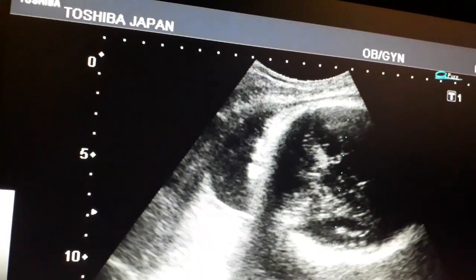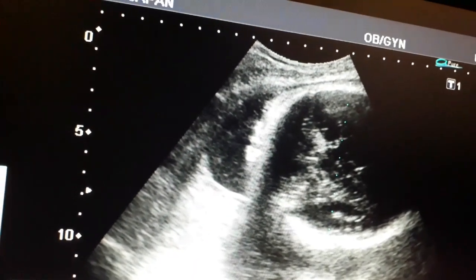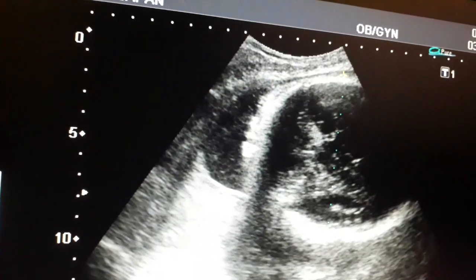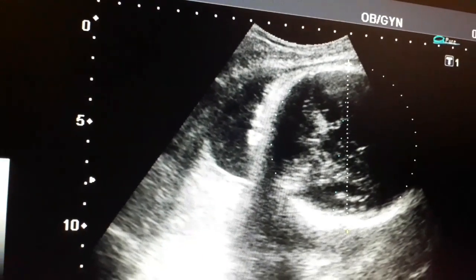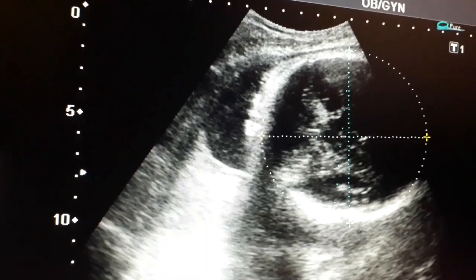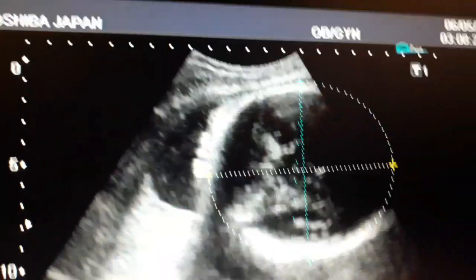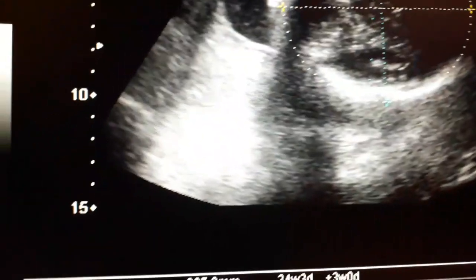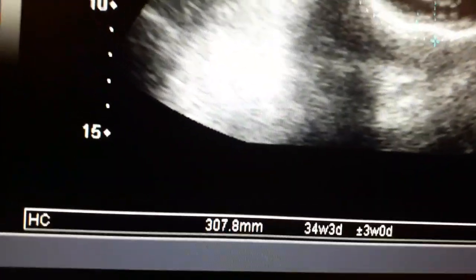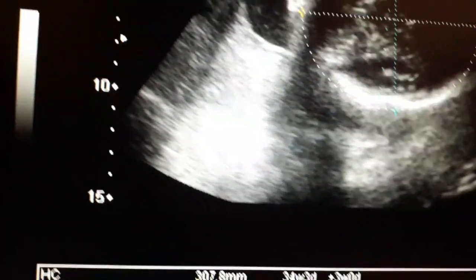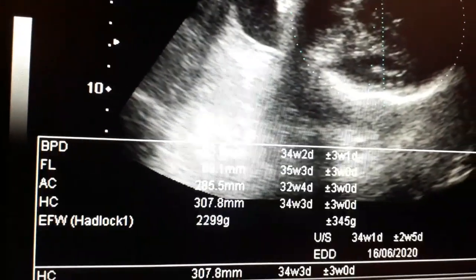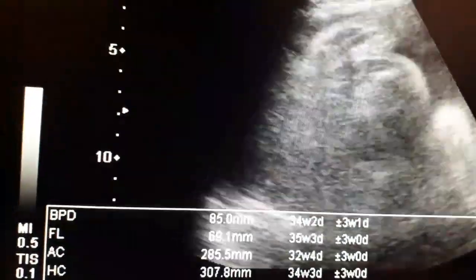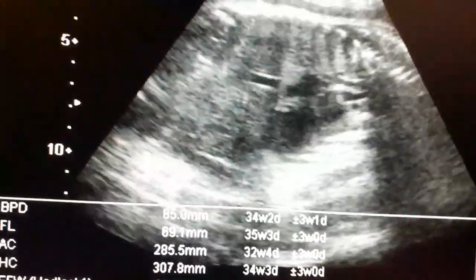The fetal age of this baby appears to be around 34 to 35 weeks. I am also measuring the head circumference, which appears to be 34 to 35 weeks gestational age.